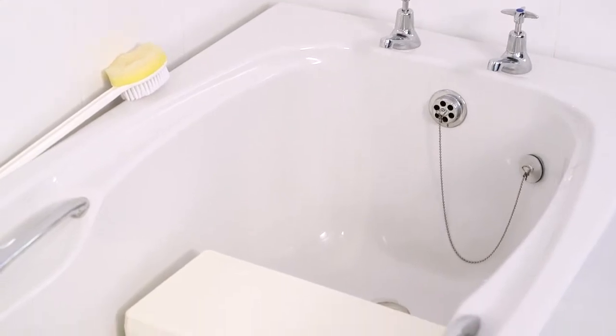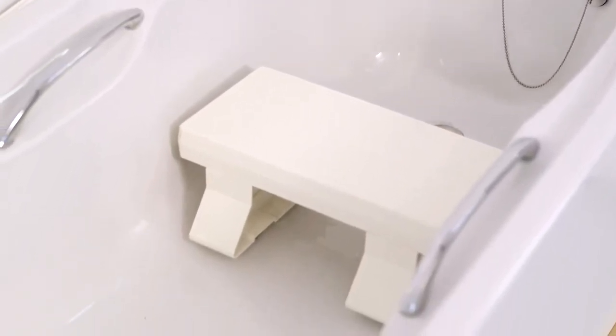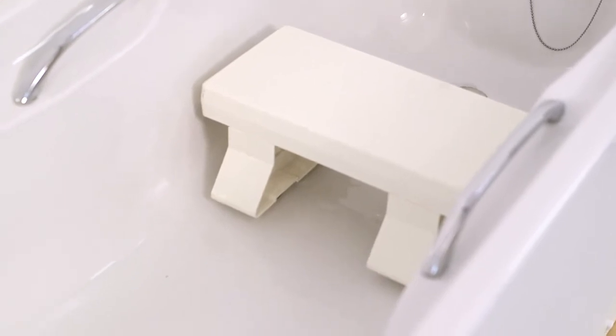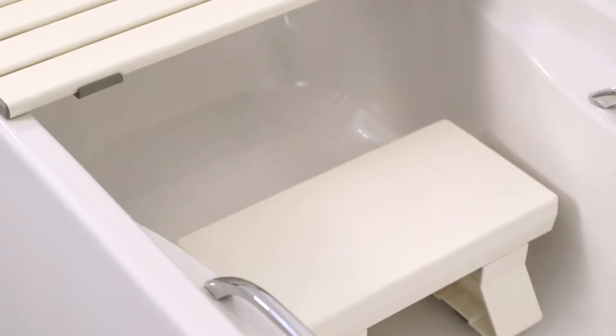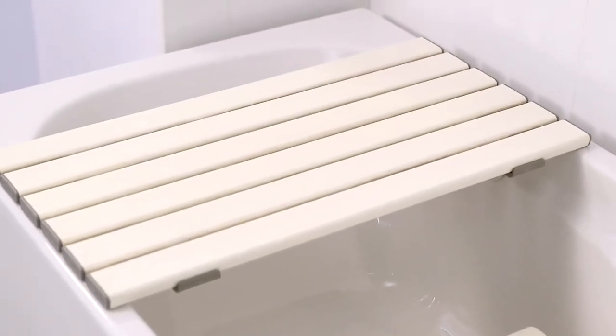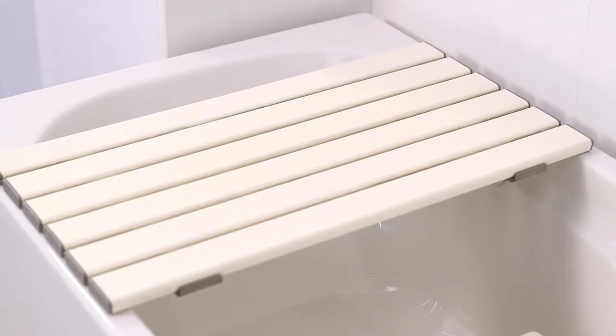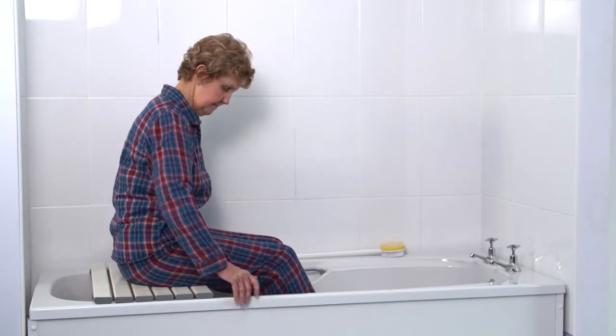A bath seat is a seat that is used as a halfway platform rather than getting down into the bottom of the bath. It still allows you to be close to the water and therefore enables you to have a wash. A bath seat is often used together with a bath board and is positioned in front of the bath board, leaving some space for comfort when sitting on the seat.